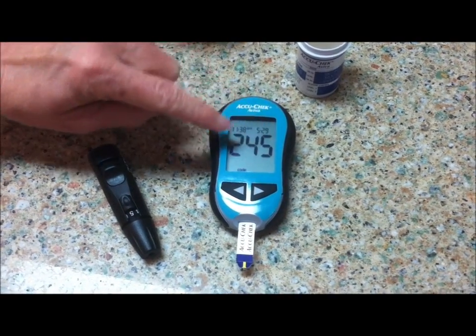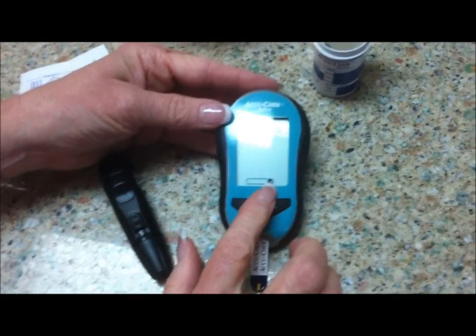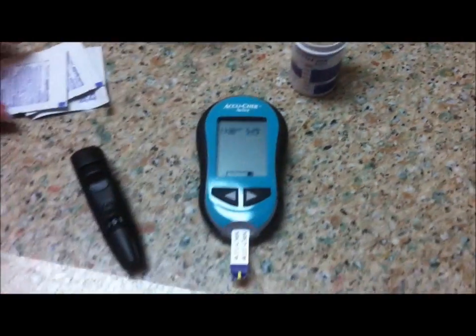It gives you the time, the date, and the code. And then when you have a little drop of blood symbol at the test strip indicator, it's ready to take a drop of blood.